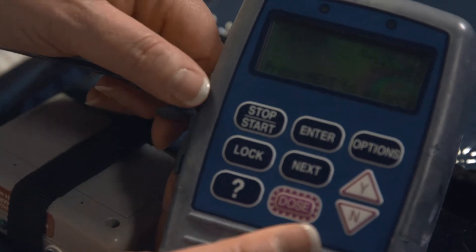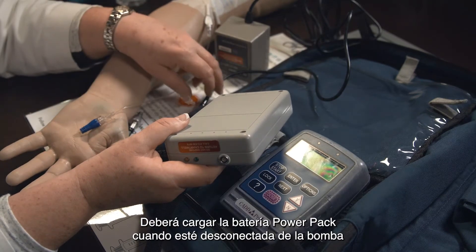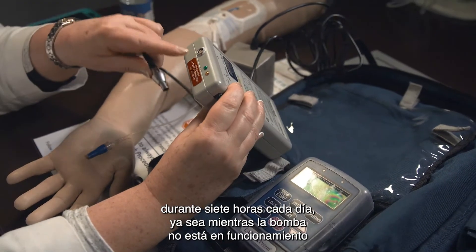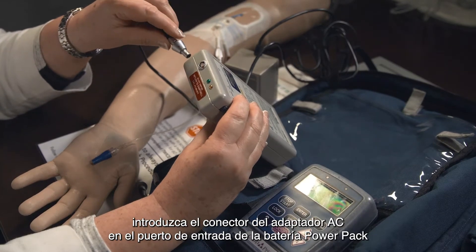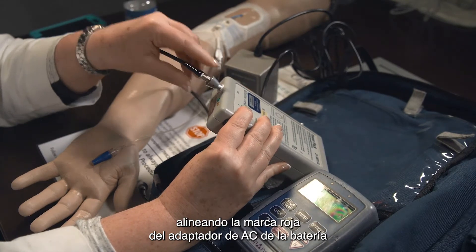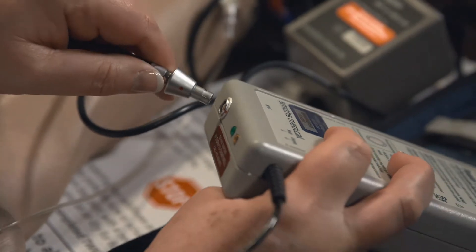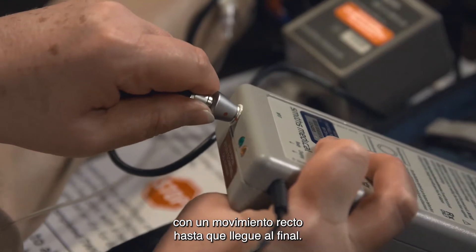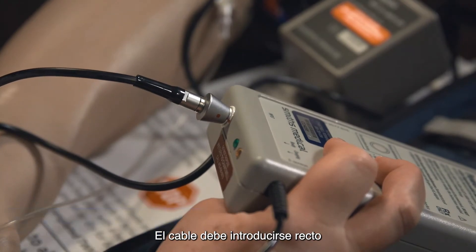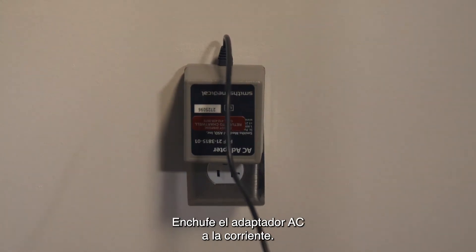Remove the power pack from the pump. You will need to charge your power pack once it is disconnected from your infusion pump, for 7 hours each day, either while the pump is not in use or when you are asleep. To charge the power pack, insert the AC adapter connector into the power pack input port by lining up the red mark on the AC adapter and the red mark on the power pack input port. Then push the connector fully into the power pack in a straight motion until it stops. Do not twist or turn the connector. The cord must be pushed in straight so you do not bend the wires inside the cord. Then plug the AC adapter into the wall outlet.